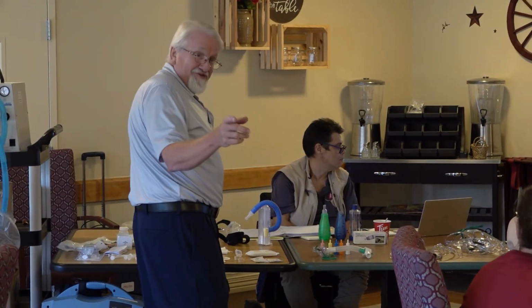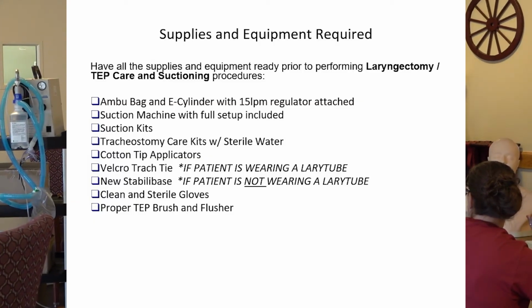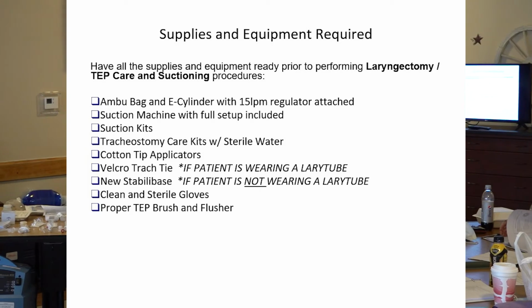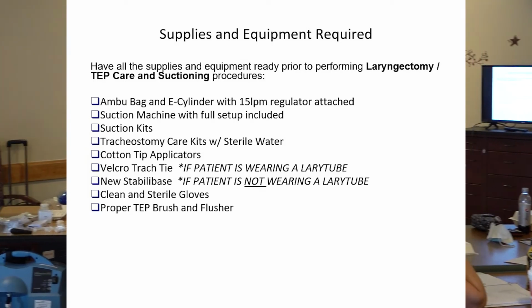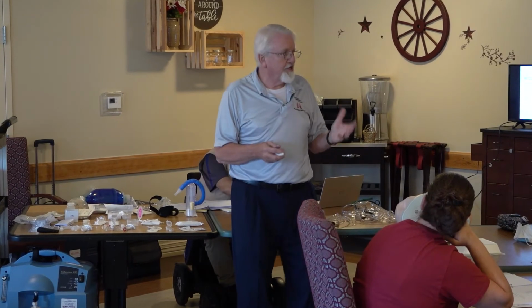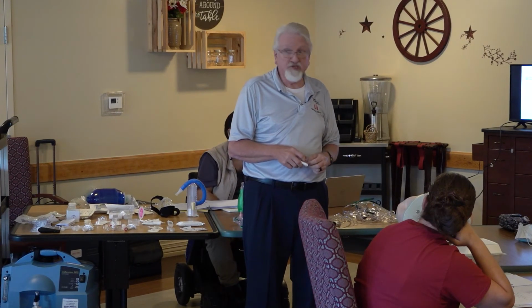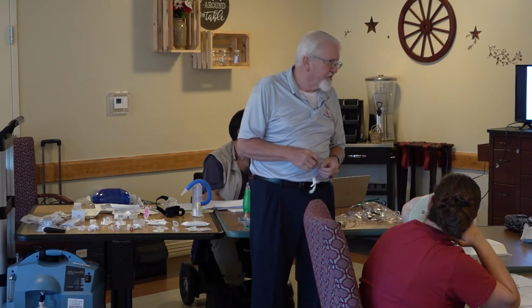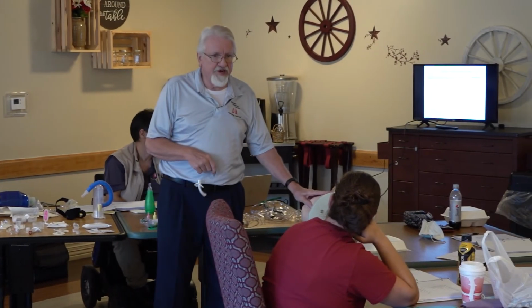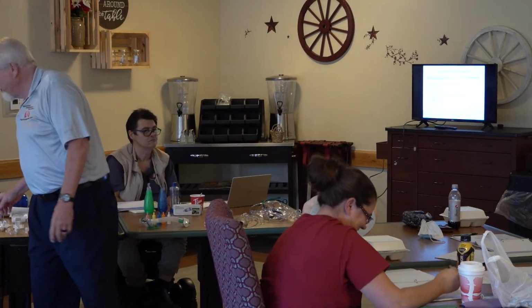Now for suctioning, this comes into where you were asking about pre-oxygenate. That's a pretty good habit to get into, especially if you're not familiar with your patient. But normally, once you become familiar with your patient, you'll know: is he one that I need to pre-oxygenate, or is he one that usually does fine?